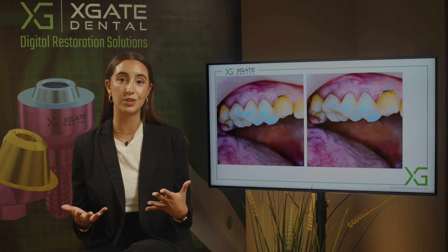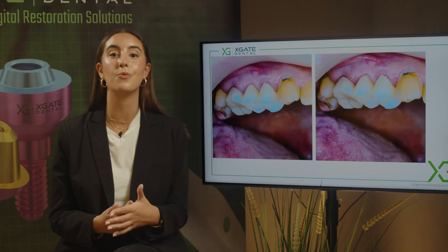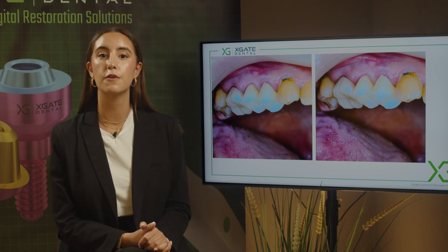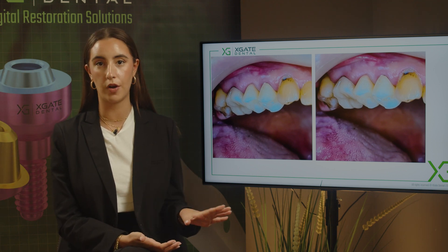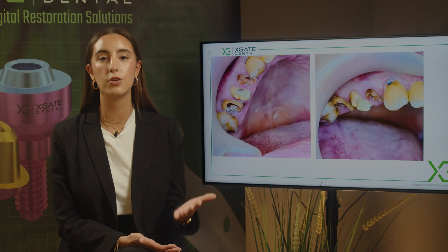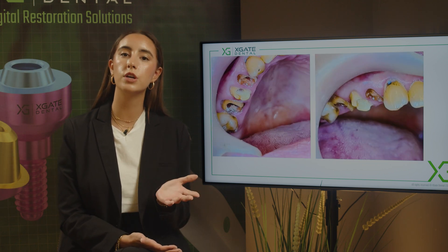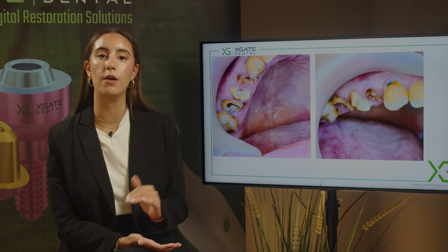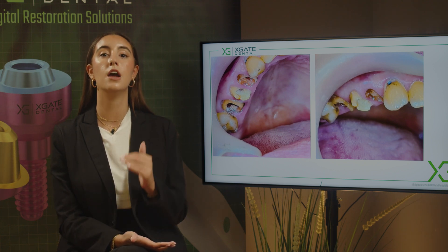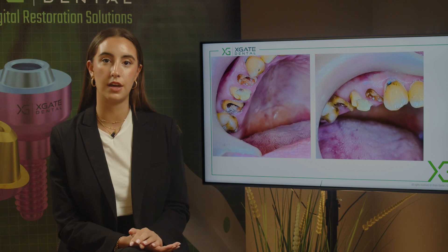In this case we have parallel teeth and parallel root canals, so it is possible to do this. What we want to show right now is how we're doing it. First, we removed all temporary tooth fillings, opened up the inside part of the tooth, and prepared the teeth. Right now we are going to scan the teeth from the outside and the inside, so our crowns are going to fit on both the outside and inside of the tooth together.